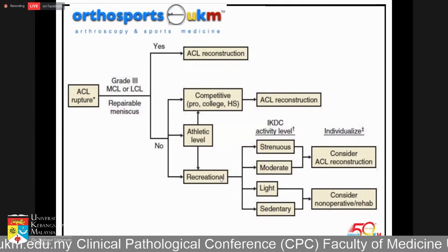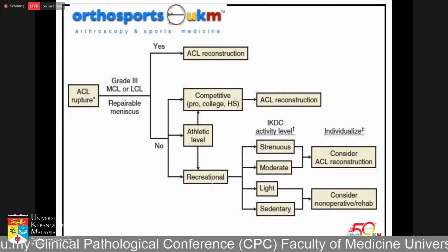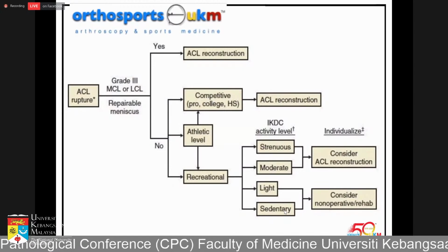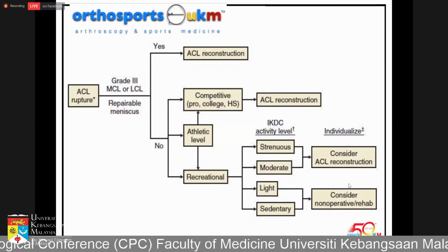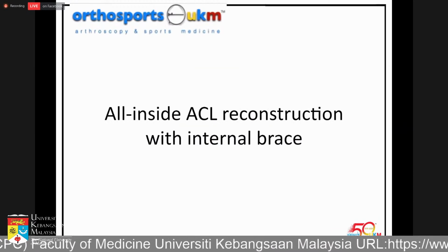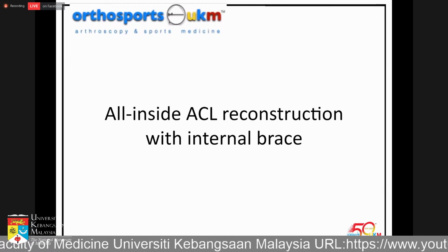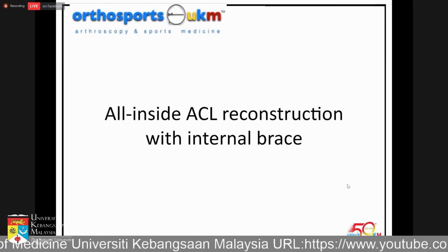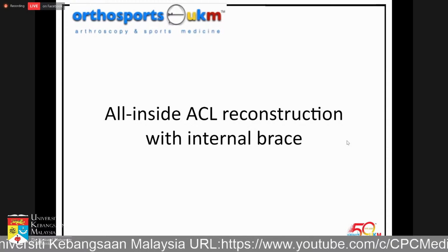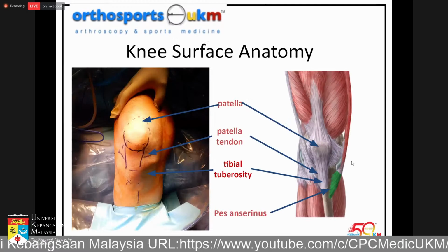But if they are playing the sports only for recreational, but the activities are light and sedentary, then we consider non-operative or rehab only for the patient. So for the patient, she's an athlete who plays badminton at a collegiate level, so we proceeded with ACL reconstruction. But what we did is an all-inside ACL reconstruction with internal bracing.